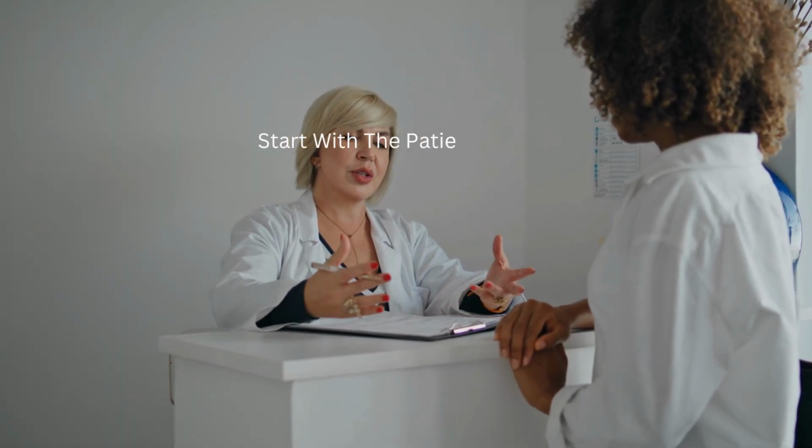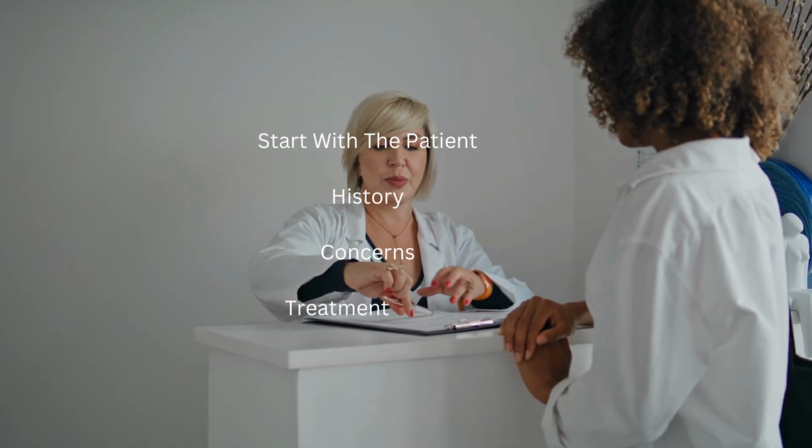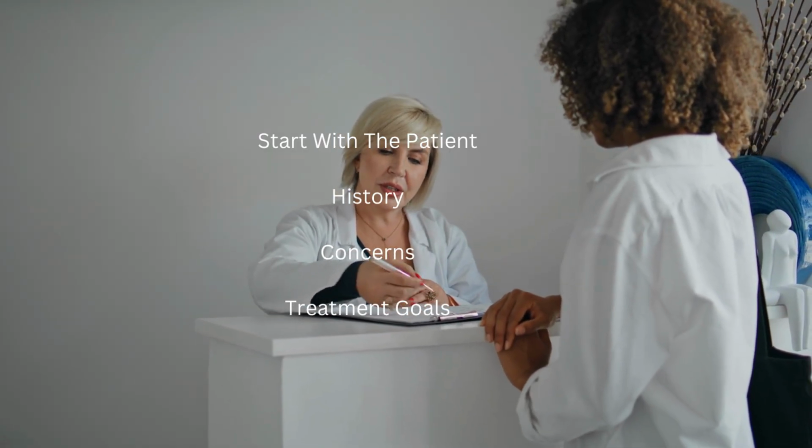Always start with the patient, not the machine. Understand their concerns, medical history and treatment goals before performing the analysis.